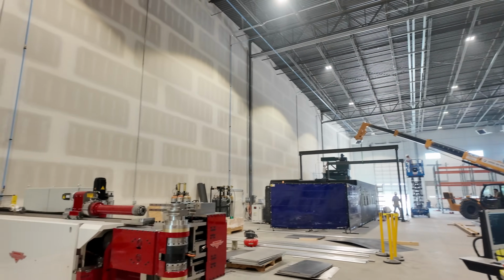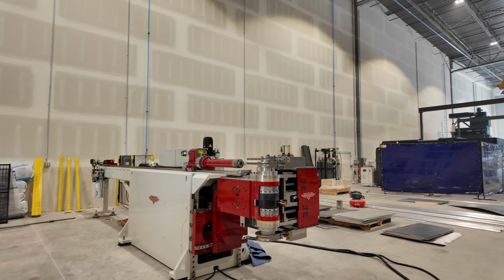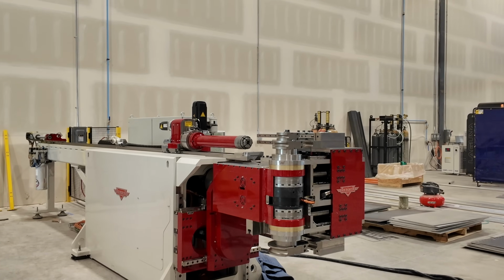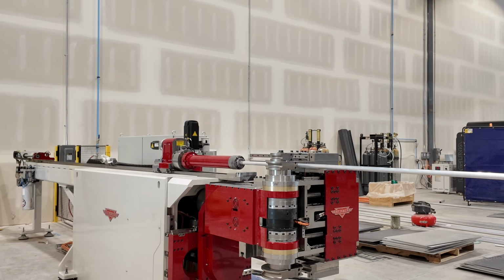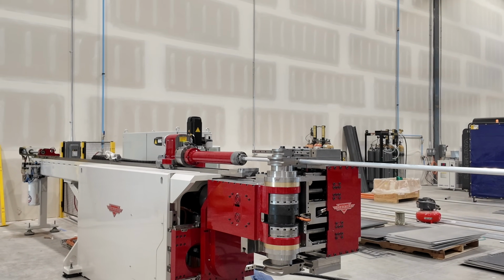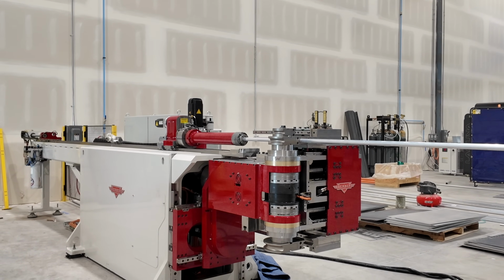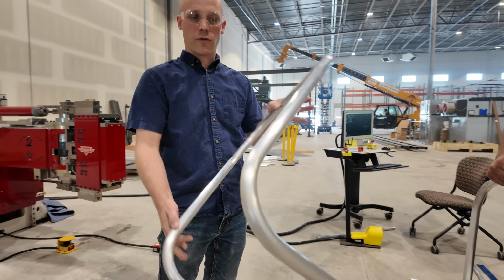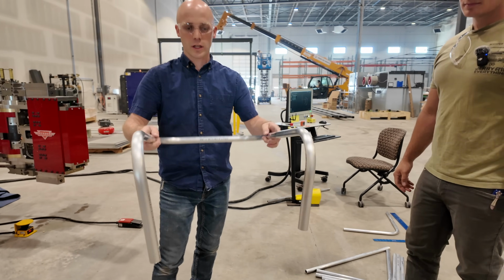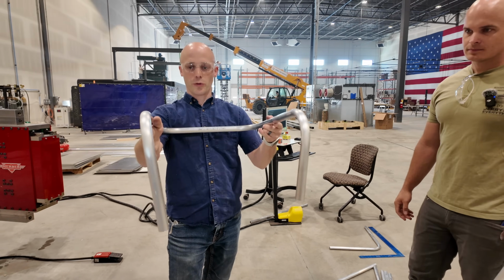It's called a rotary die bender. It's kind of like pulling the metal through the die to make these shapes, because each one of these chairs has about 1,000 different variables. It's not a cookie-cutter process. No 2 chairs are the same. When you look at this, not only do we have about 4 bends in this, but if you look at the front, you'll see that these are both tapered in, right?